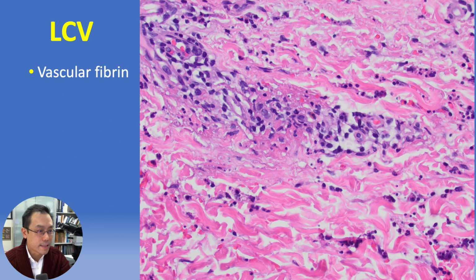And in some cases, some diligent pathologists with diligent scrutiny, sometimes additional deeper sections, may find occasional foci of vascular fibrin.